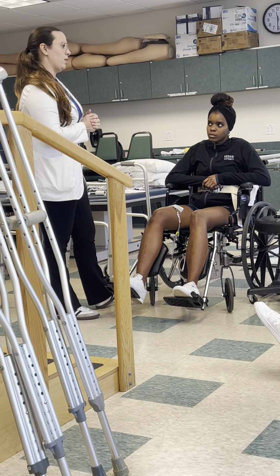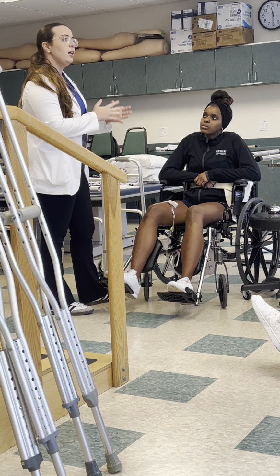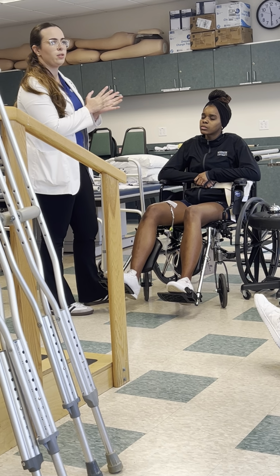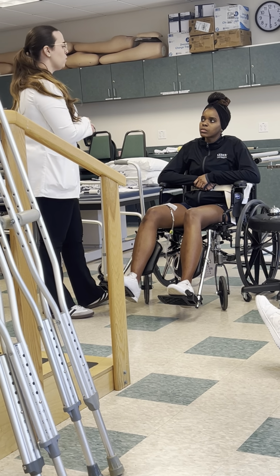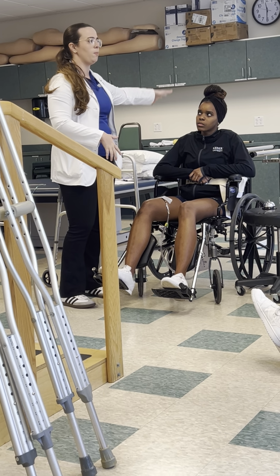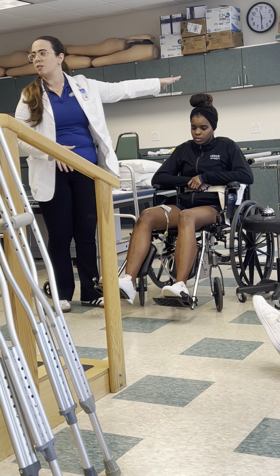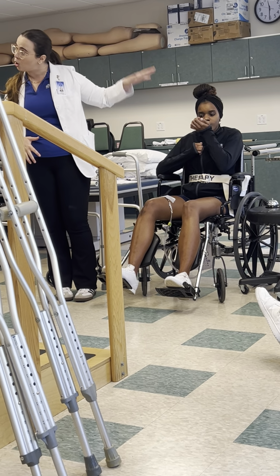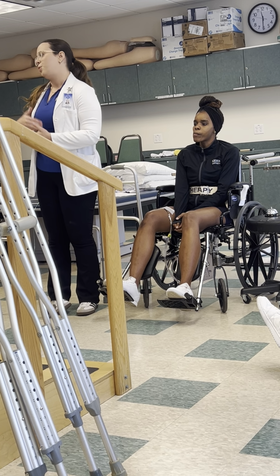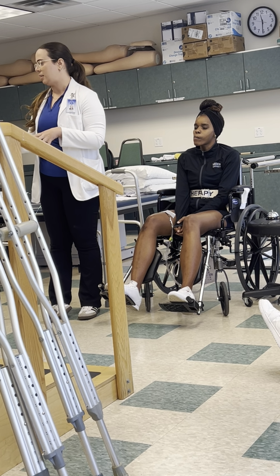Weight bearing status, very good. So reiterating once again, remember you are partial weight bearing for, let's say, your right or left lower extremity. If my patient was partial weight bearing, then before doing the assisted devices, we went into the parallel bars, we determined the appropriate weight for them, we fitted them for the assisted device, and we did gait training, so they already know what it feels like. But I continue to reiterate, remember, you're only supposed to put 50% of your weight. What it felt like when we were gait training is exactly what you should maintain while stair training as well.